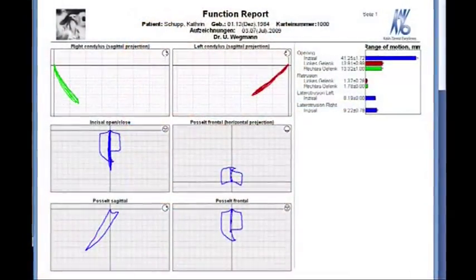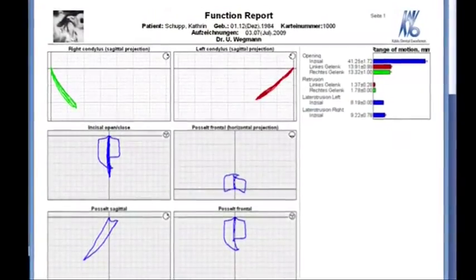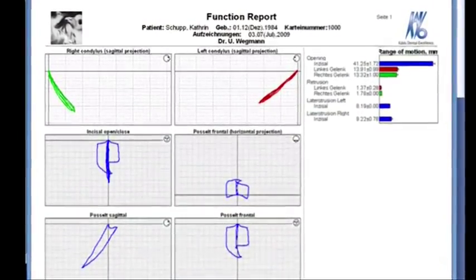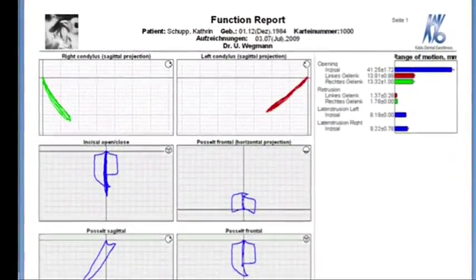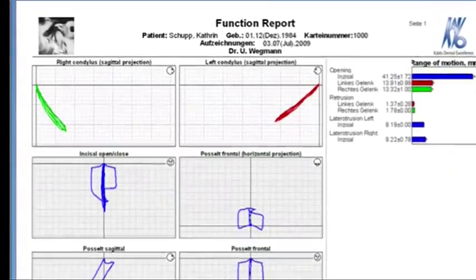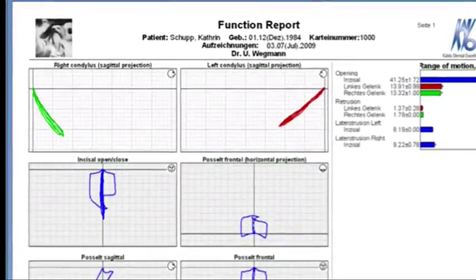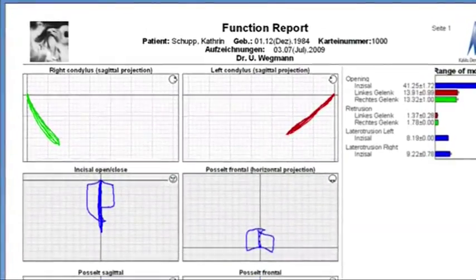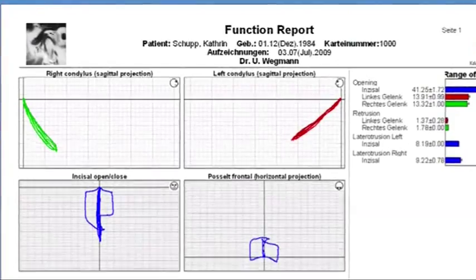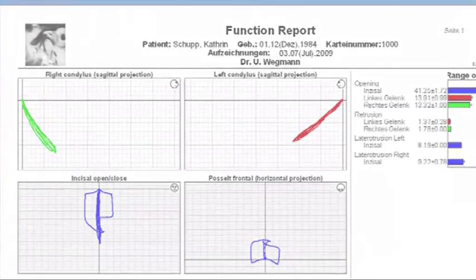Clinical and instrumental functional analysis is the basis of the finding survey. ArcaStigma analyzes and documents all important information in a lucid form.